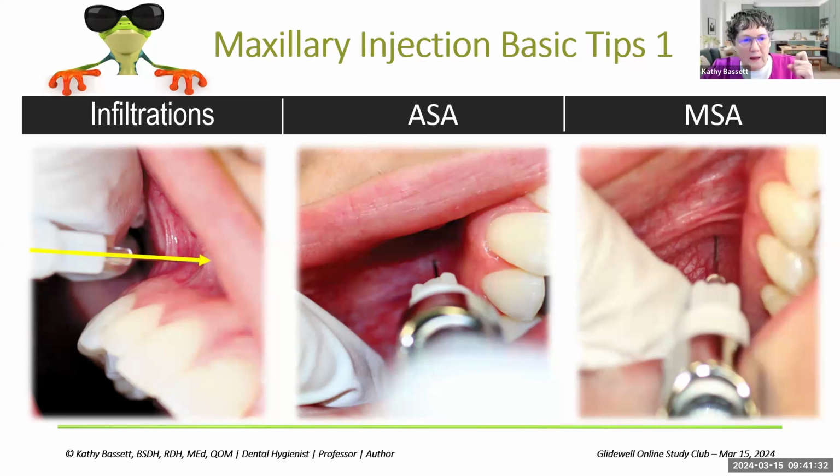We're estimating the height of the apice, and we just need to get that drug adjacent to it. So if you regularly make contact, I encourage you to just shift that angle a little bit and work to not making contact. And I think you're going to see a lot of change in the behavior of the patient in response to that. Additionally, we can see that same nature of opening that area up, gently lifting tissue lateral. And this is opposed to folding it back, pulling it upward, and literally compressing all the tissues against the maxilla.